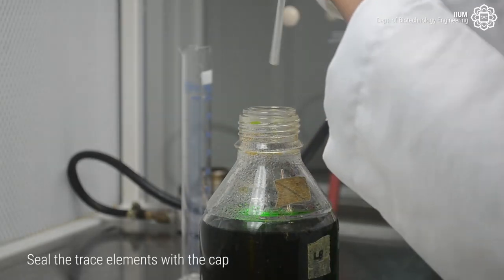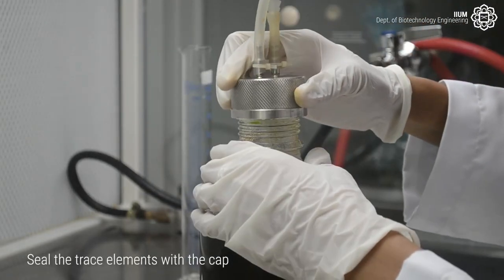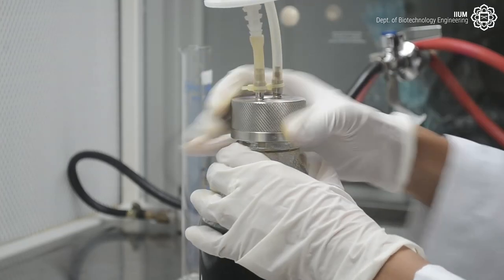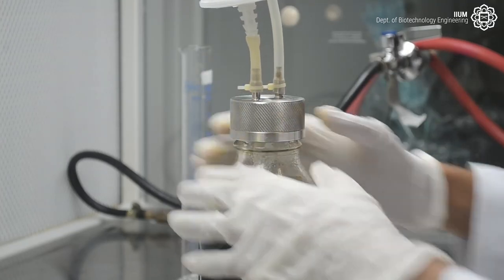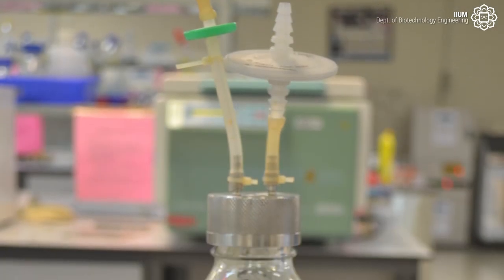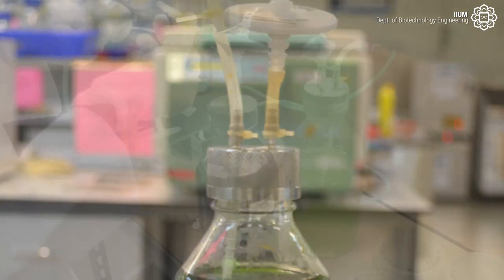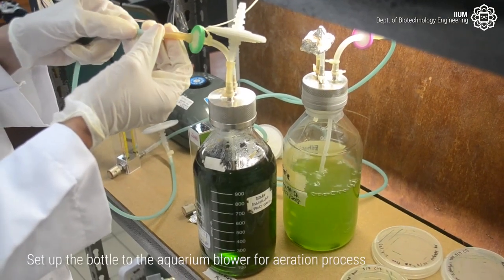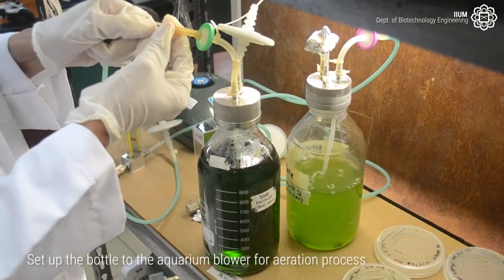Seal the trace elements with the cap. Then set up the bottle to the aquarium blower for the aeration process.